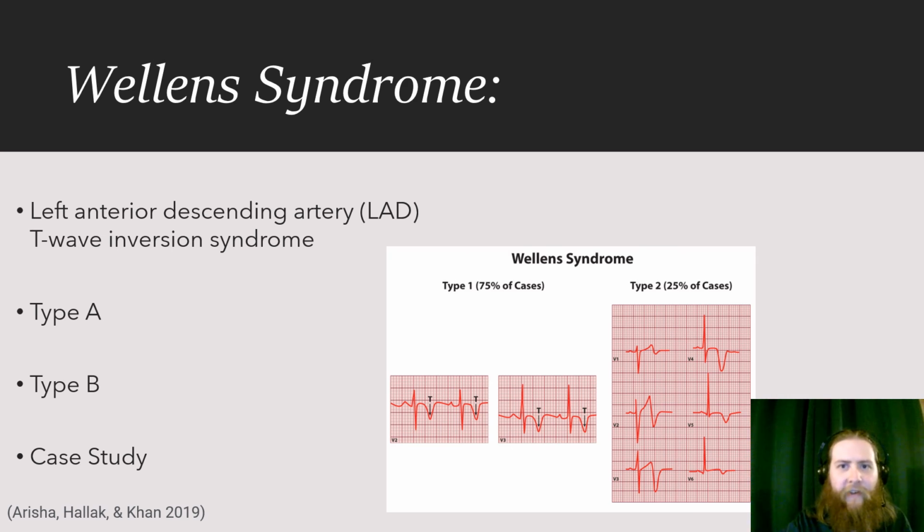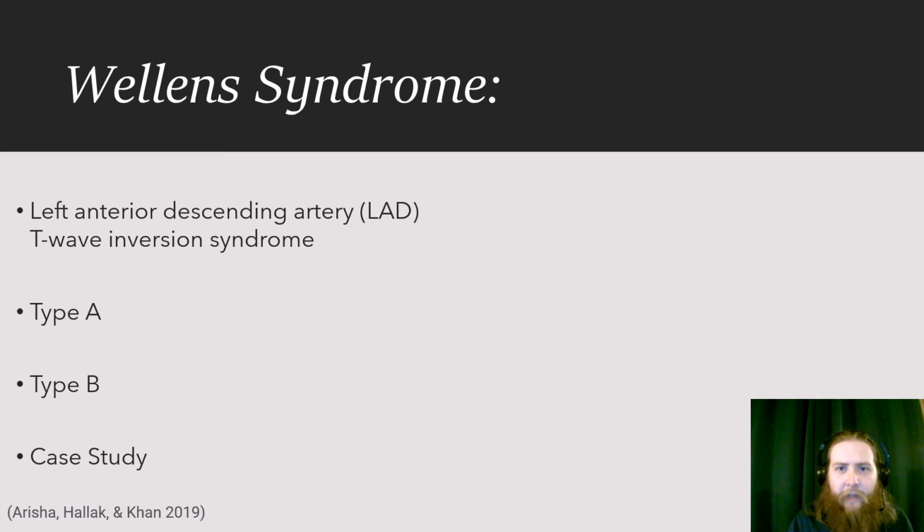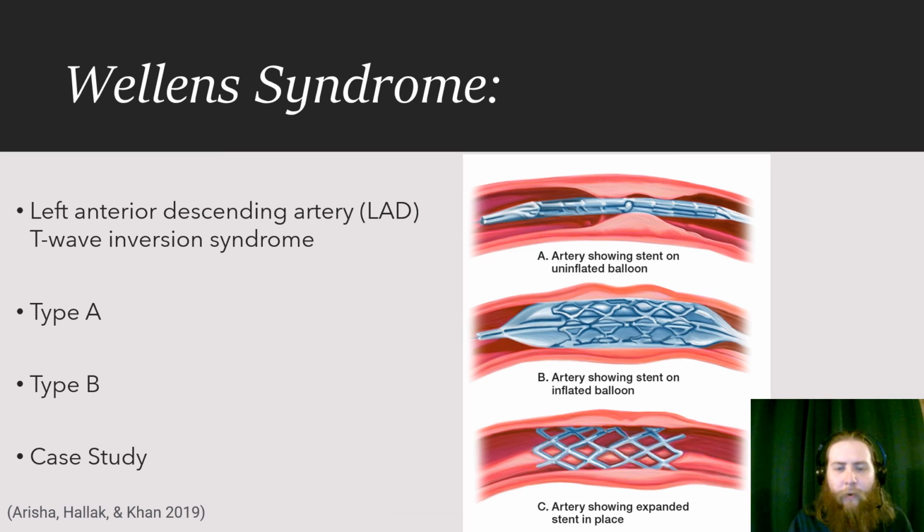drug-eluting stent, or a DES, and this is how they work, where they're inserted with a balloon in them, and then that balloon gets blown up, and then the balloon gets taken out after it gets deflated, and this stent is left. And the DES, also working as a support, also elutes a drug. So it's going to release a drug, helping to prevent the proliferation of tissues in there. And this will slowly happen.